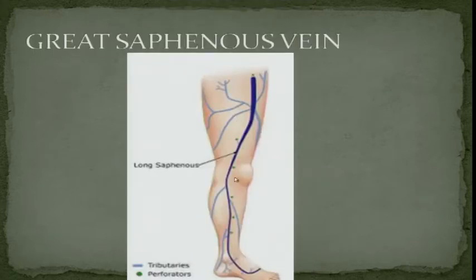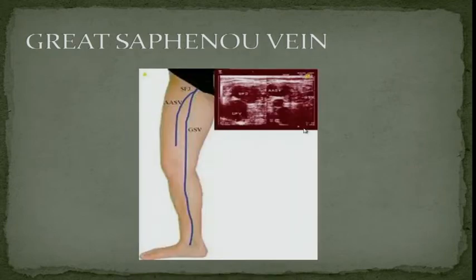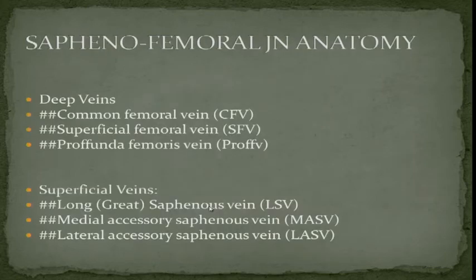So this is another image telling us the same thing, that this is the great saphenous vein. If you see from here to here, other than the small perforators, there's a rather long length that can be harvested with success. I've done a lot of surface marking because it's easy for us to say where it is, but when the ultrasound technologists are actually going to scan every millimeter of this vein, it is a painstaking evaluation. When we do the venous reflux study, and I will explain that, it takes about 45 minutes to 1 hour, 15 minutes to do it on a patient.